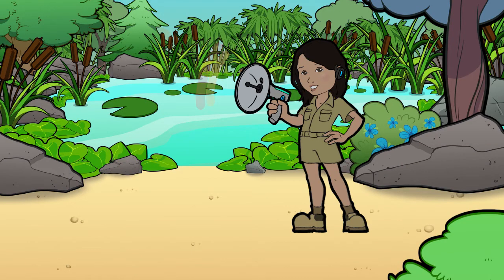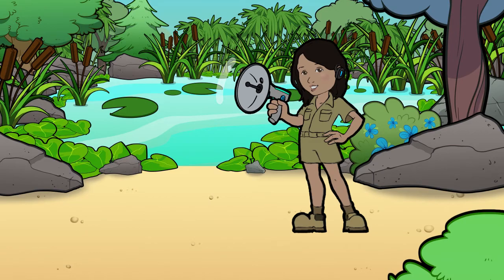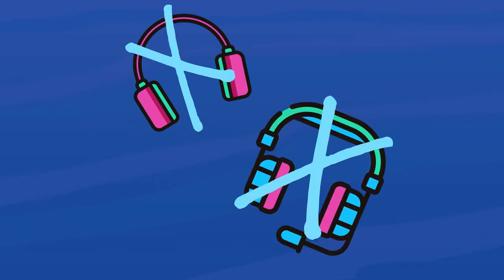Hey there, I'm Emily. Do you have a good pair of adult headphones and a smartphone or tablet? Yes? It sounds like you're ready to go. When choosing headphones, avoid children's and gaming headphones. They can affect the sound in the game and may negatively impact test results.